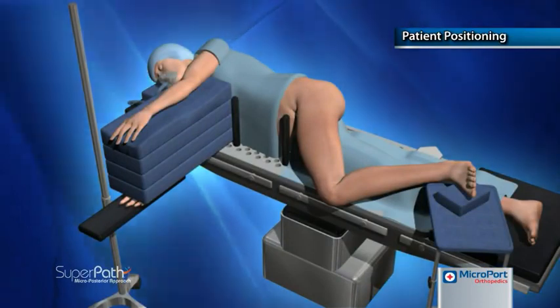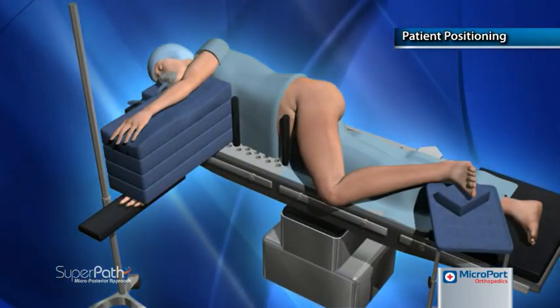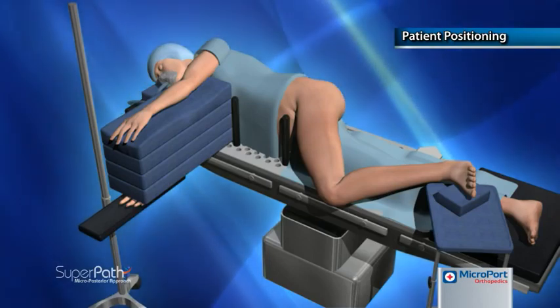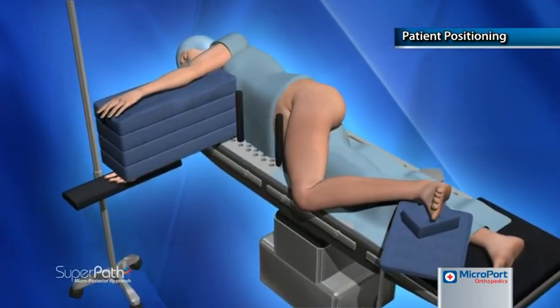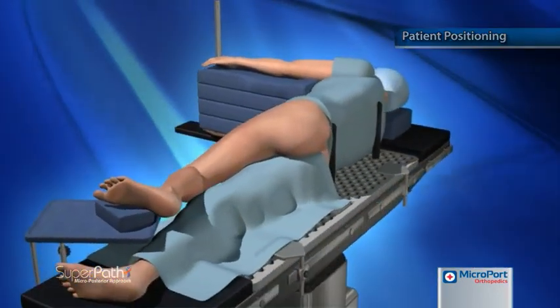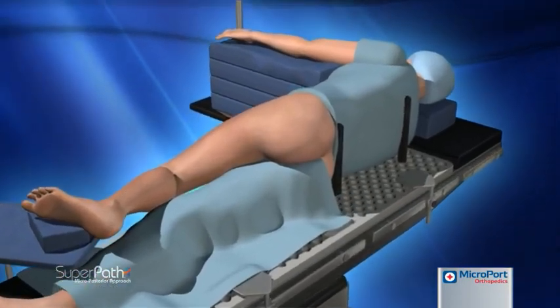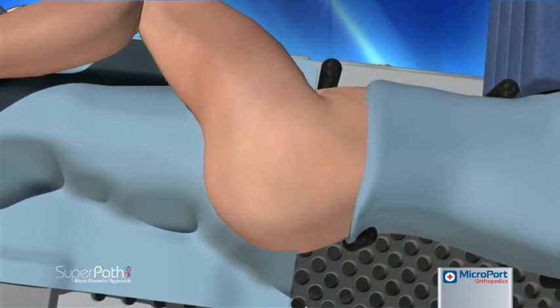The patient is secured in a lateral decubitus position on the operating table, preferably with the use of a pegboard and radiolucent pegs to permit a good quality intraoperative x-ray. With the pelvis leaning slightly posterior, flex the operative hip 45 degrees and internally rotate the operative leg 10 to 15 degrees to orient the greater trochanter upward.